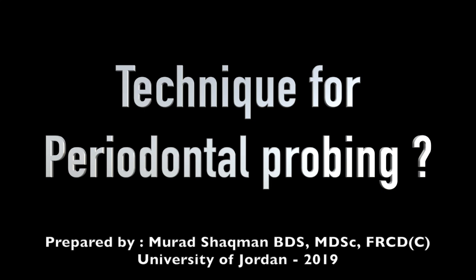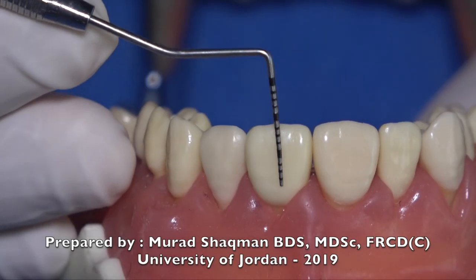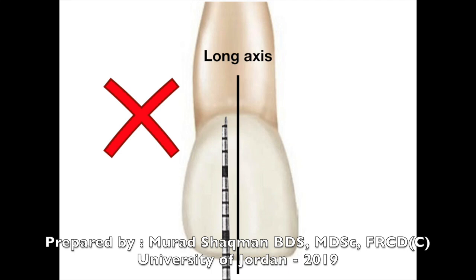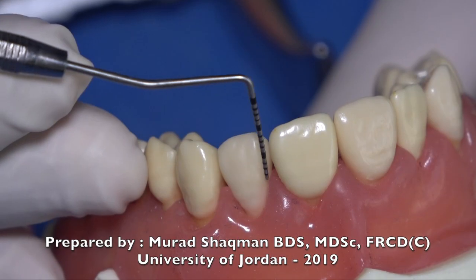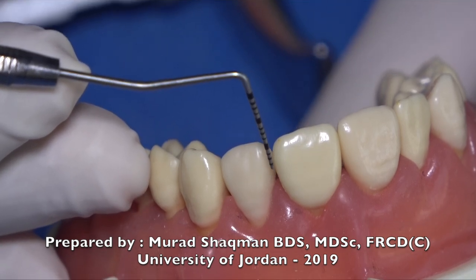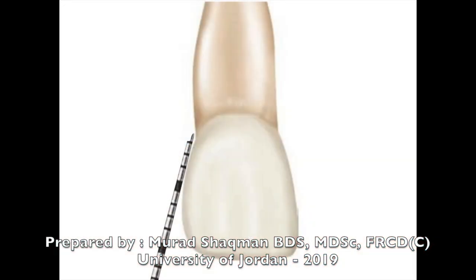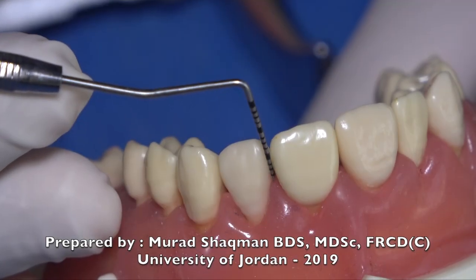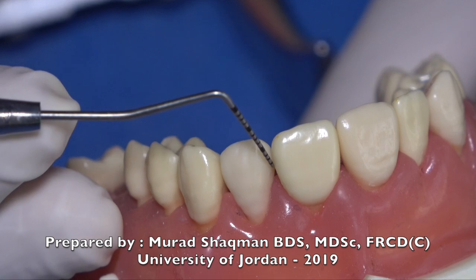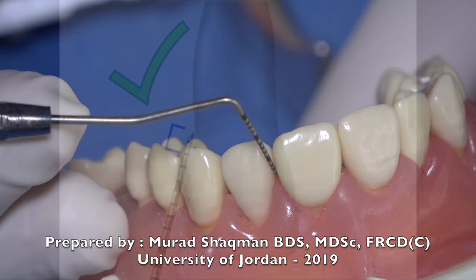When probing, we are not placing the probe parallel to the long axis of the tooth — that's not what we want to do, especially on the proximal. What you want to do is have the first two millimeters of the probe flat on the surface you're probing. To achieve that, you have to tilt your probe a little bit. This is the proper angulation in the interproximal area.